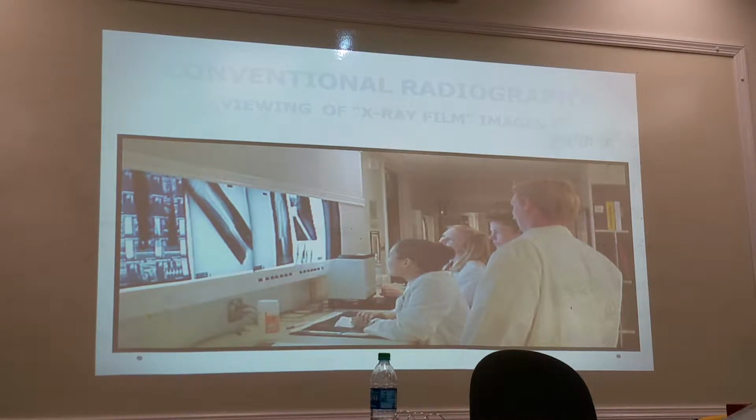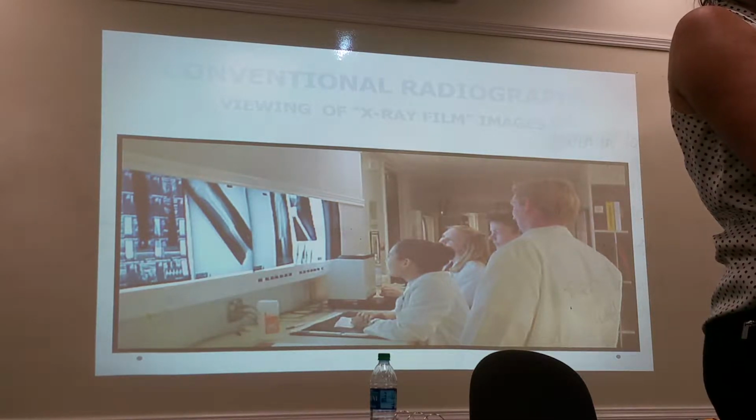Okay, so let me give you a little brief history. What we had before, Wilhelm Conrad Röntgen took an X-ray on these, and you have to be real careful. Glass plates. I've not ever seen this before until I came here to Cypress College. What's the issue with glass? Very fragile. There's tape around the edges so you don't cut yourself. The hazards of being a radiographer. It's glass, so they do break. This one is from 1920.